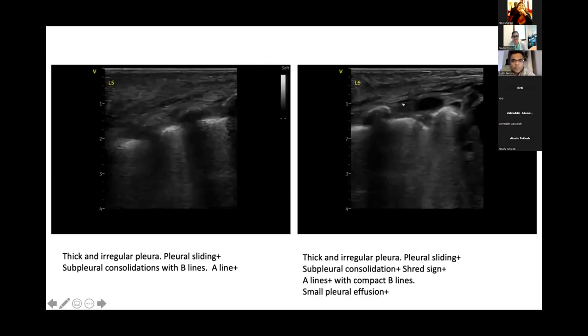No, thank you so much. Sorry, did you put Doppler on the bigger tissue-like sign on the right side that has persisted? No, I didn't put the Doppler there, Nadia. Probably in my next scan I should. It would be very interesting to see. Maybe it would be something surprising that could give some information towards diagnosis. That's a good thought. I didn't think of that, but next time when I scan, I'll do it.